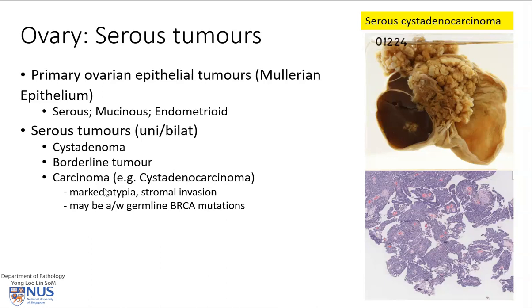These tumours feature marked architectural atypia — we can see very complex papillary structures — as well as marked nuclear atypia and invasion into the stroma, which is the cyst wall. These tumours may also be associated with germline mutations in BRCA genes, and hence associated tumours such as breast carcinoma and endometrial carcinoma. Serous carcinomas associated with germline BRCA mutations may also present with carcinoma of the breast, fallopian tube, and potentially other sites.